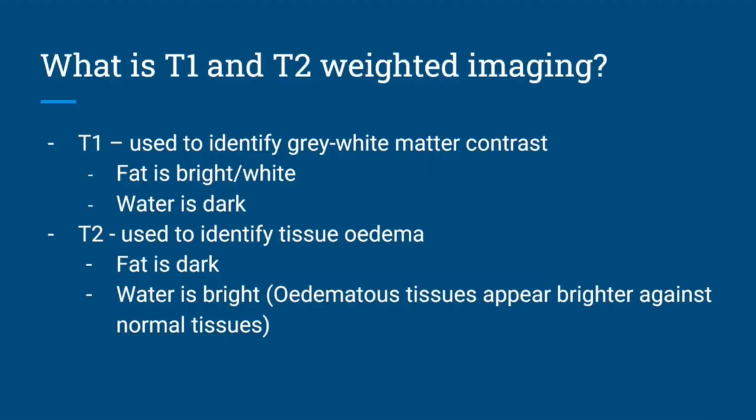We might have heard of T1 and T2 weighted imaging. Do any of you want to hazard a guess about what T1 and T2 is or does? I mean, the result is the brightness of water in each scan, and I just know that water is white on a T2, because in T2 it's the film Terminator 2.